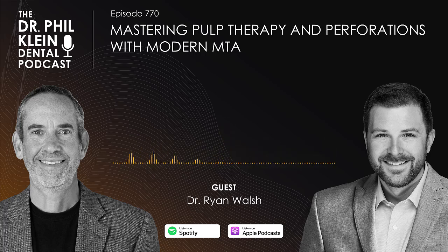What kind of sealer do you use in your practice? Yeah, I'm using an MTA based sealer. Okay, so you have an MTA. Yeah, back in the day, Roth cement was very popular. The reason why I used it was because the actual powder was so finely ground that when you add the eugenol, it was just so creamy, and there was no impedance to dropping the accessory cones in one after the other. At that time we were using lateral condensation.